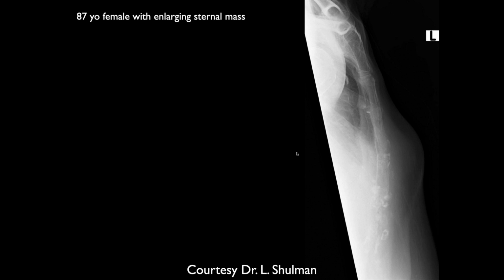It was a while in the early days of MR. What really drove MR in the early days wasn't the imaging; it was the concept that we could actually image biochemistry and actually quantify the amount of different chemicals in tissue non-invasively and do what's called the non-invasive biopsy.